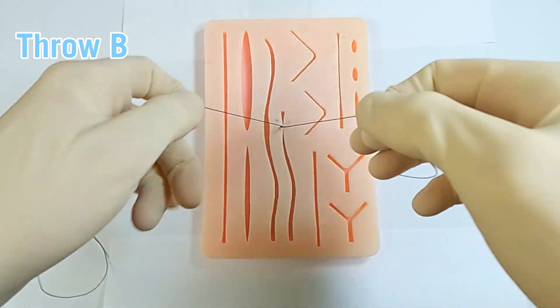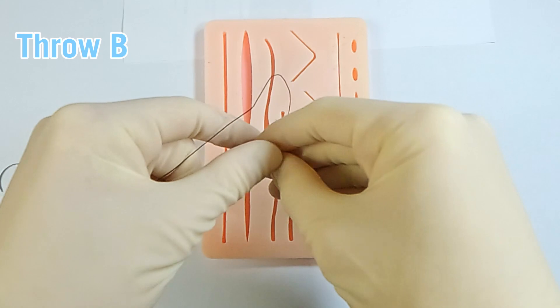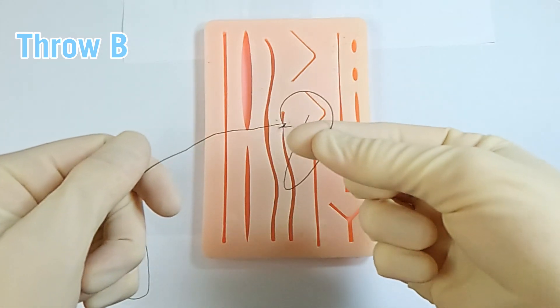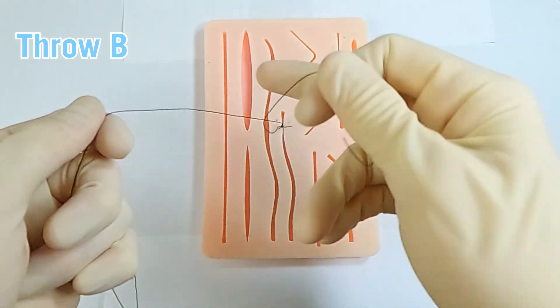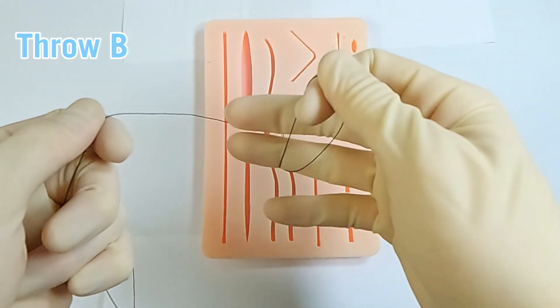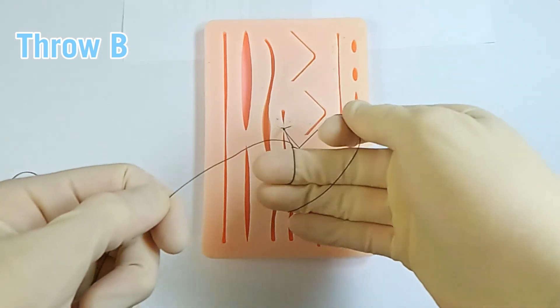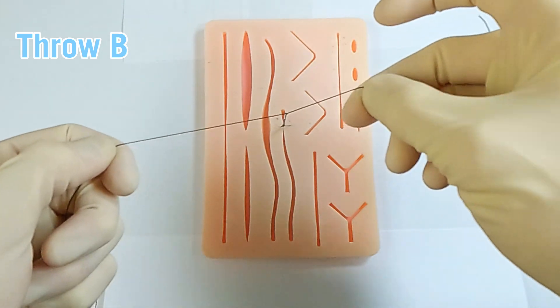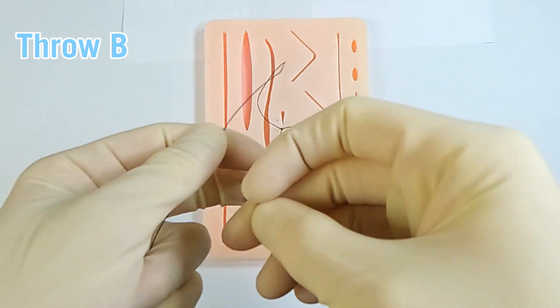Now throw B, where there are again a couple of different variations. I always want to pinch between my thumb and index finger, free end either pointing away from me or towards me. I can reach across with either three fingers, two fingers, or just one finger. In any case, I bring my post side over, middle finger, flex, over, under, extend, and bring the suture material through so I can re-pinch between my thumb and middle finger, ready for back to throw A.